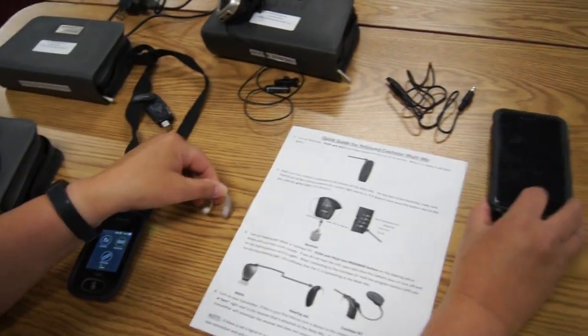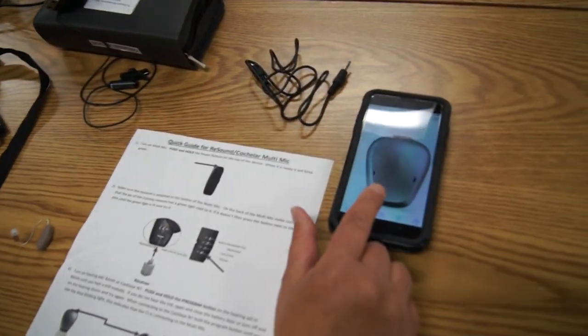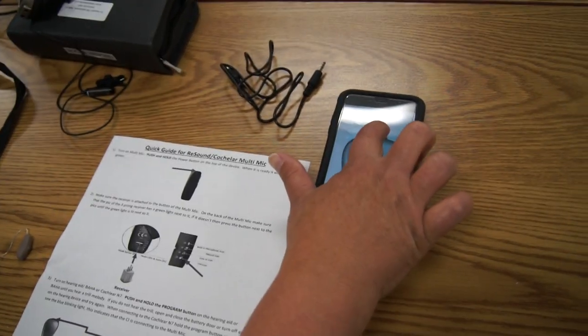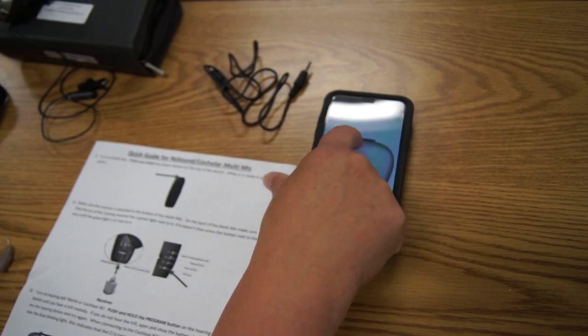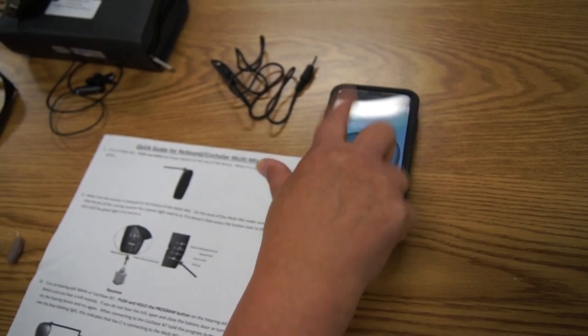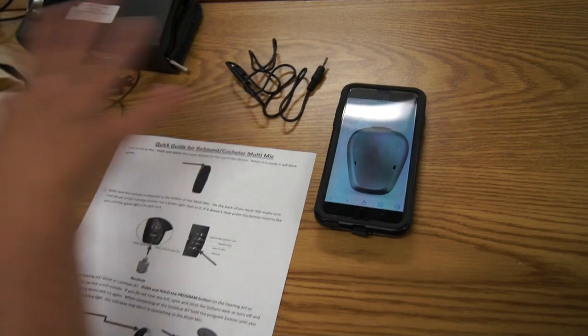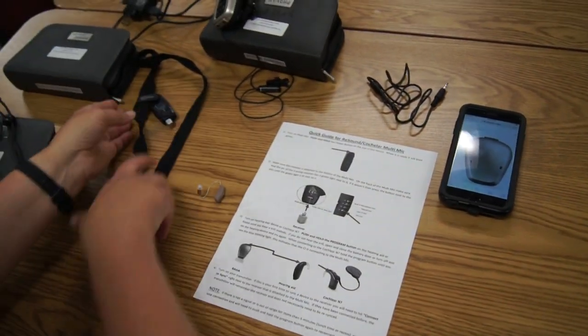If you have a student that has a cochlear BAHA, the button is at the top. You're going to do that same thing—press that button down until you hear the trill. That sends it into that program and then you should be able to hear.